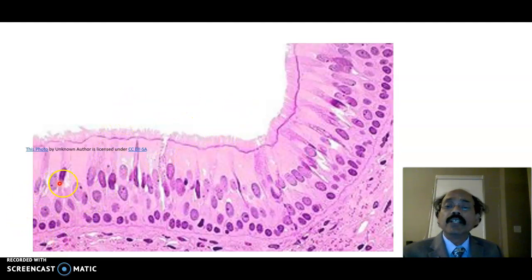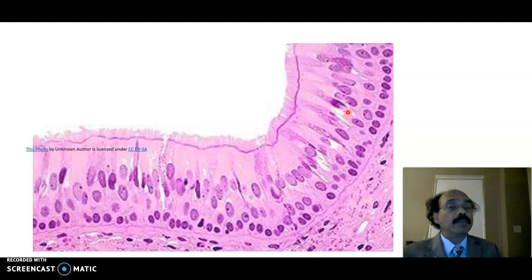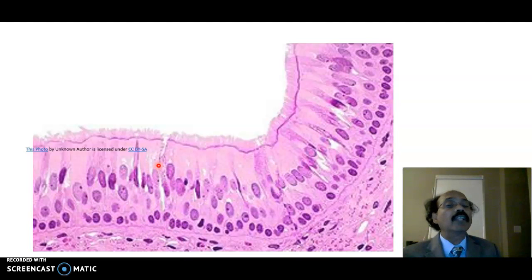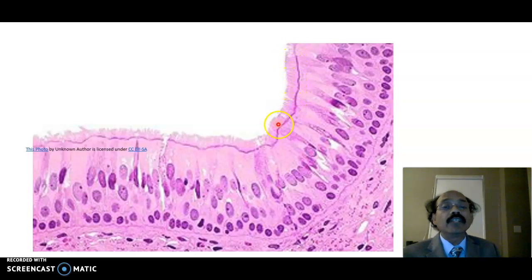This is the pseudostratified ciliated columnar epithelium. When we look under the microscope, the nuclei seem to be at different levels, making it appear like a multilayered epithelium — but it is not; it is a one-layer epithelium. We have different types of cells: basal cells, columnar cells, goblet cells, DNES cells, serous cells, and mucus cells. These are the cilia — projections from the cell surface. We also have microvilli and brush cells present here.